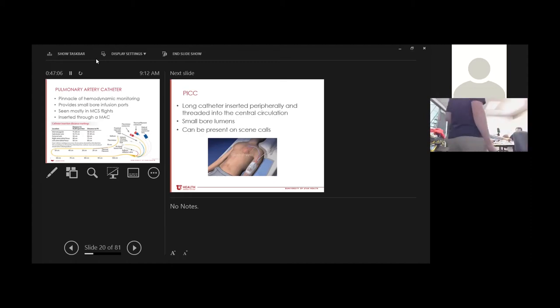And if this whole thing is secured well. Okay, now why doesn't this have a securement in the back? So this locks. The MAC is going to be sutured in, right? And then the swan, but this doesn't have this thing. You're right, this doesn't. It's gotten ripped off. They always come with this.